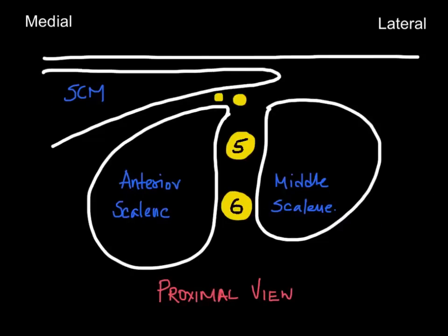When we move the probe a bit more proximally, we find that the bulk of the interscalene muscles becomes a bit smaller and usually only two nerve roots, C5 and C6, are visible in this proximal view. The phrenic nerve or the accessory phrenic nerve, as shown in this representation, lies very near to the C5 nerve root. Therefore injecting at this particular plane means they are more or less bound to be involved.